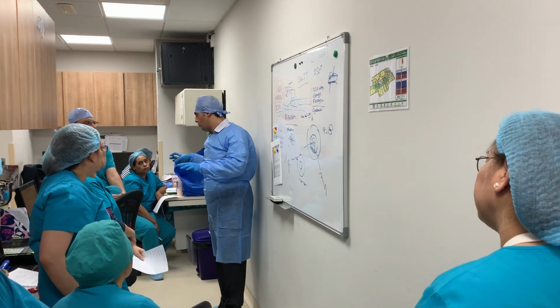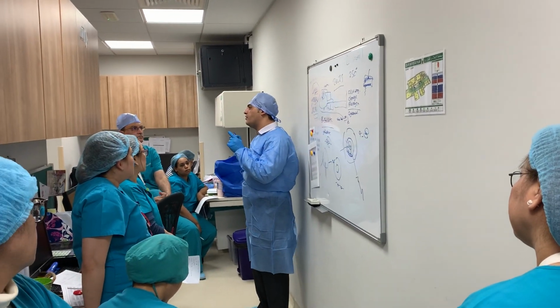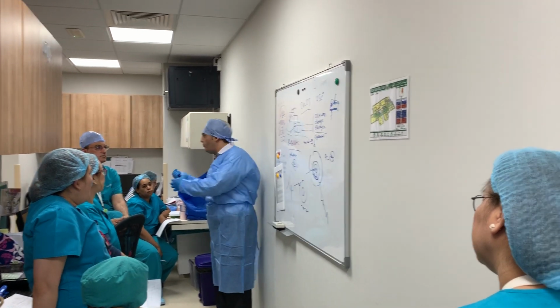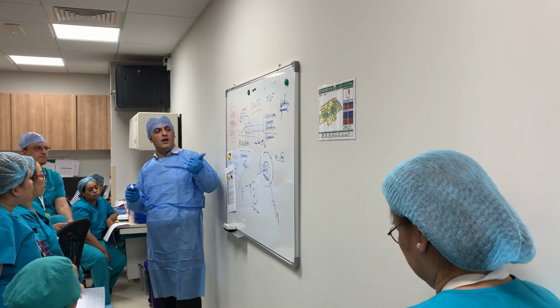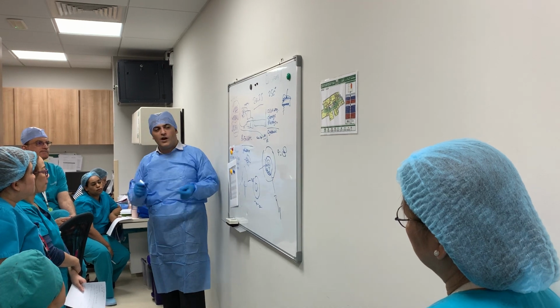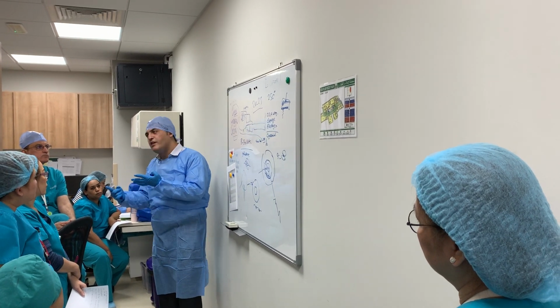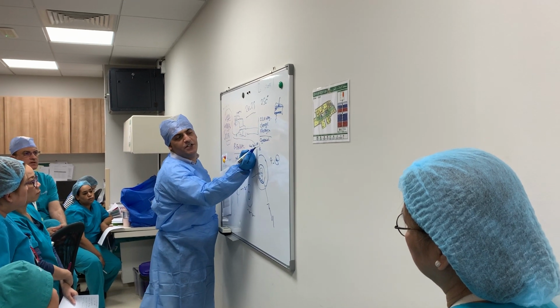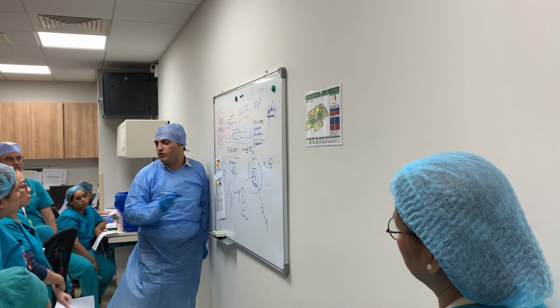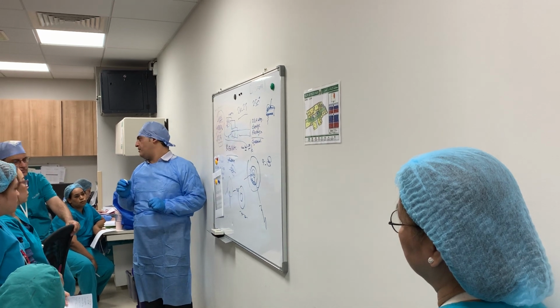Volume doesn't matter at all. Concentration matters. You're manipulating volume according to what style you prefer to use. You can do the same MACS selection in 1 ml, half a ml, or 300 microliters. What we care about is having a concentration that's adequate to the amount of particles in 50 microliters. Yes, exactly.